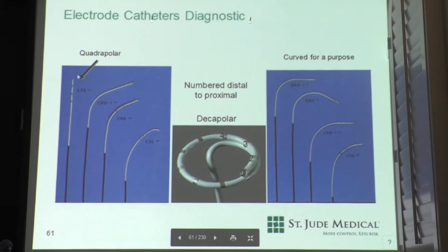They're typically named by, you know, the number of electrodes on them. So you see the little metal parts here. Each one of these is capable of collecting a signal from the endocardium. And we use that to help determine how much voltage is there, who's happening first or last, right? So activation sequence is very important for understanding how arrhythmias are happening. And then if it had an ablation tip on it too, we would use that to deliver heat.